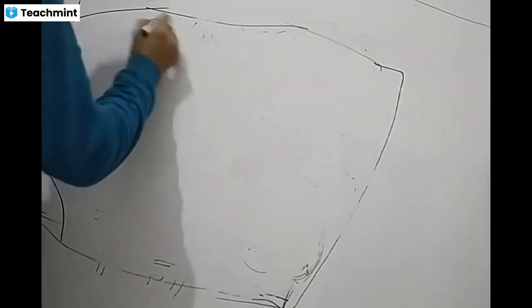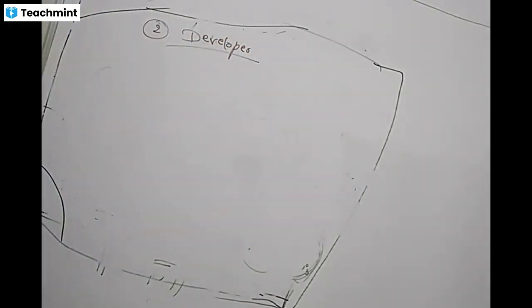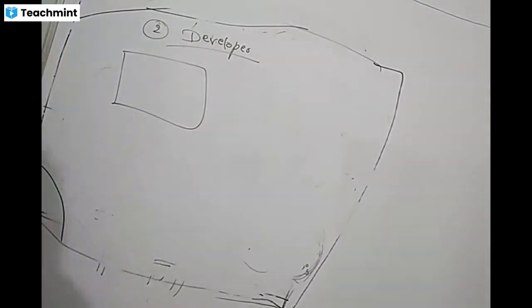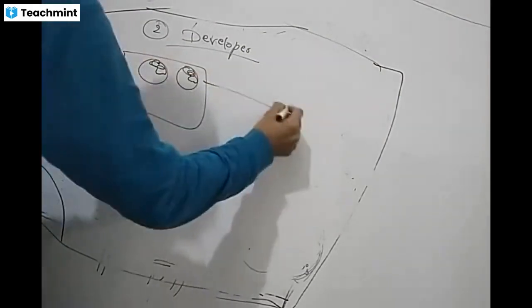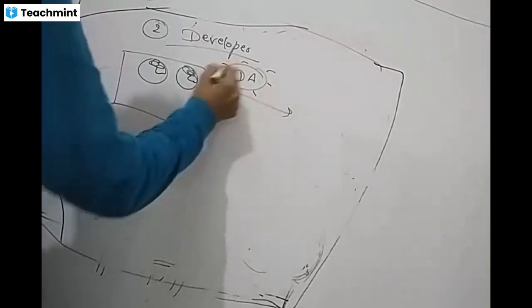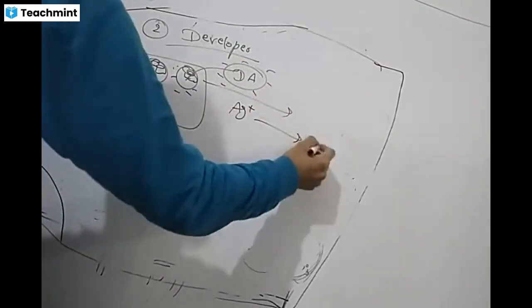The second step is the development, use of developer. What is the role of this developer? As I told, this is the film emulsion which is having latent image. The developing agent has negative charges, it will enter and reduce Ag+ to Ag.